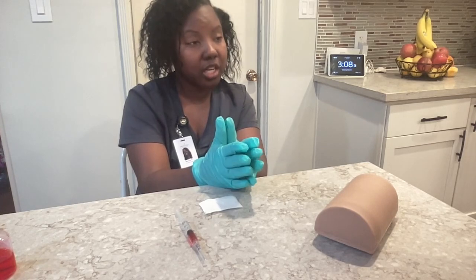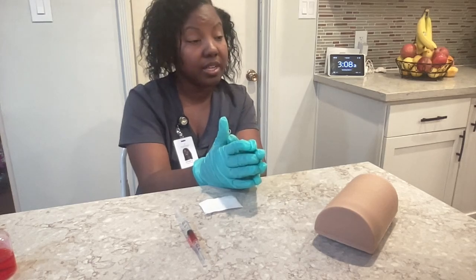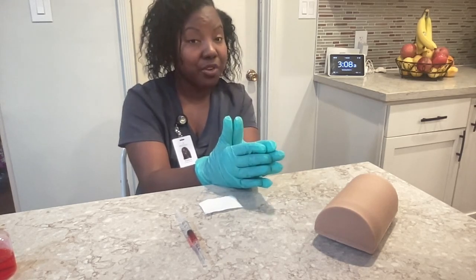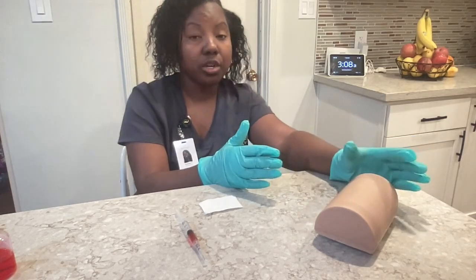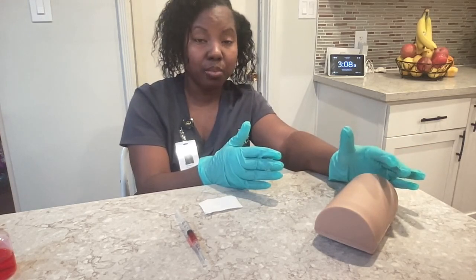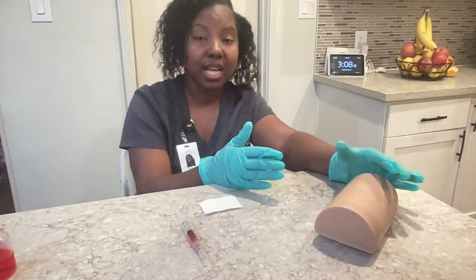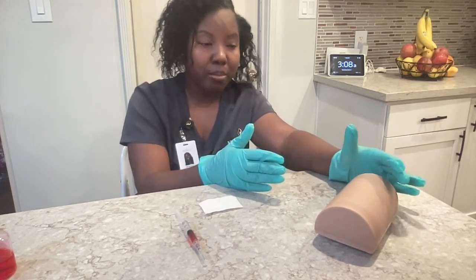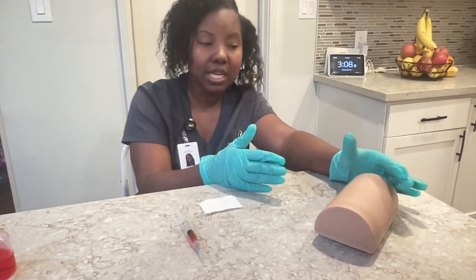I just need to check your site to make sure it is appropriate to receive the injection, so I am going to need to touch you. If I can have you lie on your side, please. When assessing the area, you want to check the size and integrity of the muscle. You want to make sure that there's no bruising, no edema, no skin discoloration.